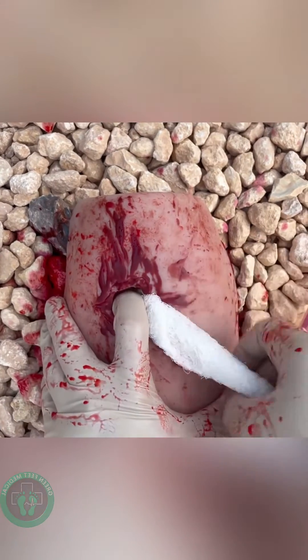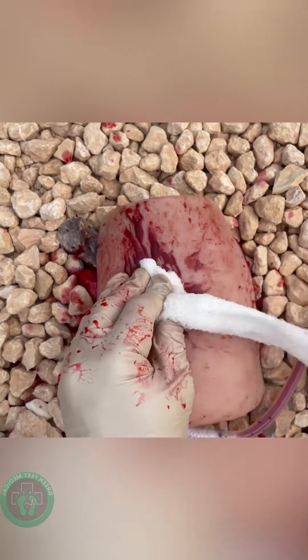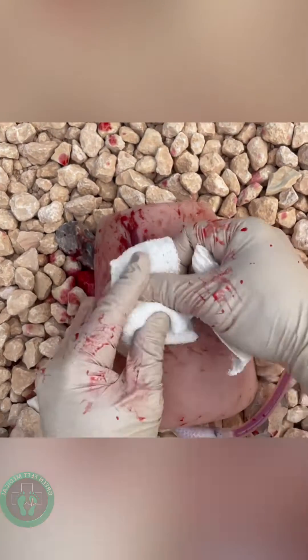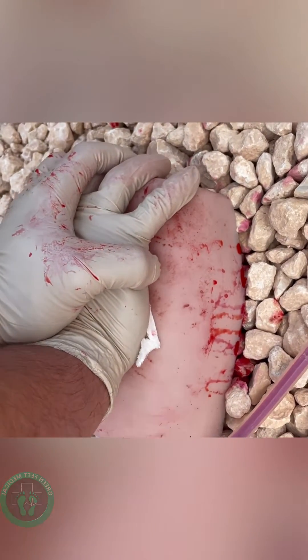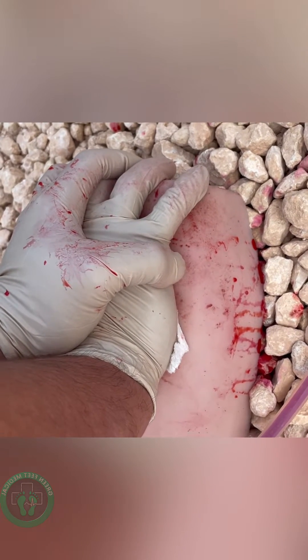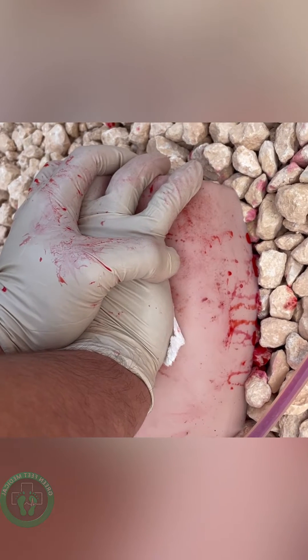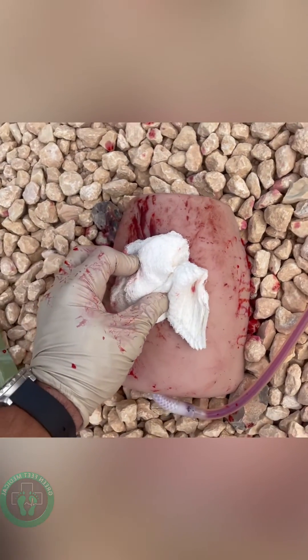So I've pushed and replaced. Now you've finished the wound. You're going to continue packing until you have a mound of gauze on top of this wound so that you can hold pressure using your skeletal structure. For standard gauze, you're going to hold pressure for at least five minutes, and if you have hemostatic gauze that went in first, for at least two and a half minutes — holding directional pressure against that artery. After this, you'd apply a pressure bandage.